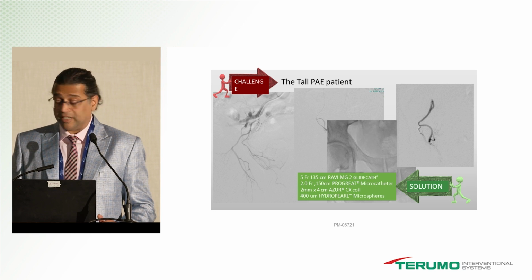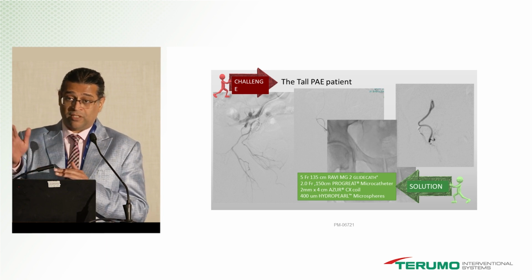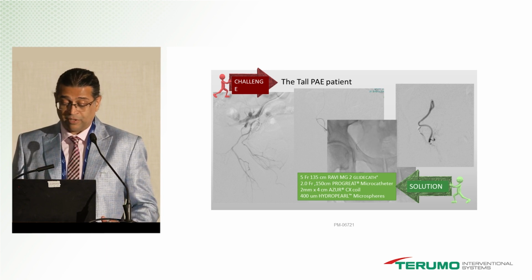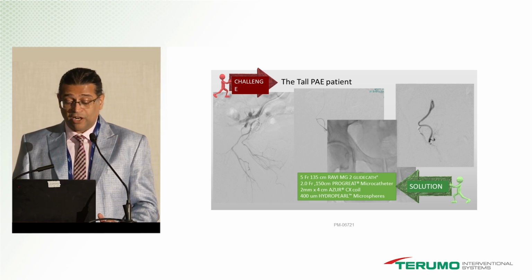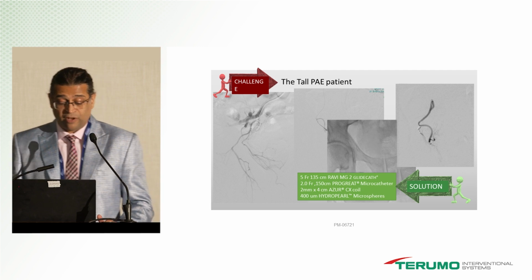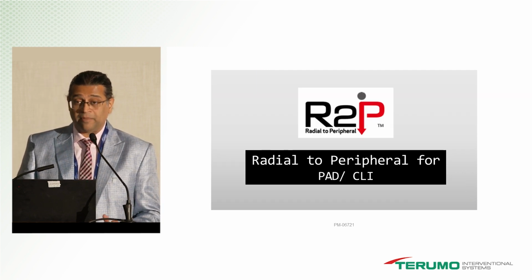And then if you see that there's no blood flow going down there, and I got in, then the prostatic artery actually bulked up a little bit because now the flow was diverted towards the prostatic artery, and then we went and put the beads there. So again, in 2023, we have a lot of solutions to this patient. We have a lot of tools that we have to help these patients.